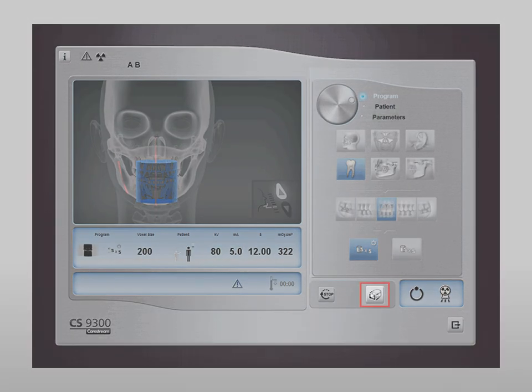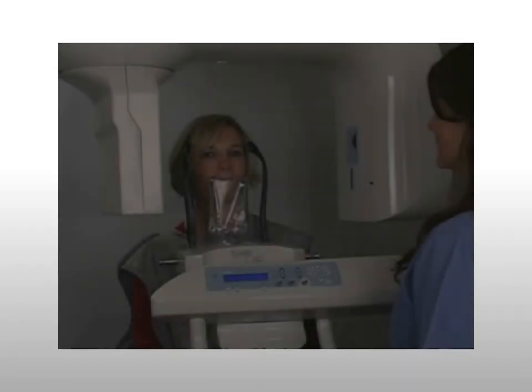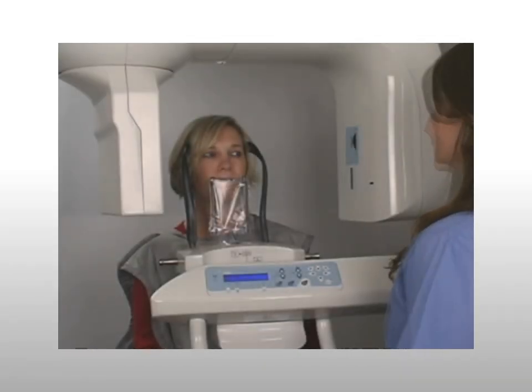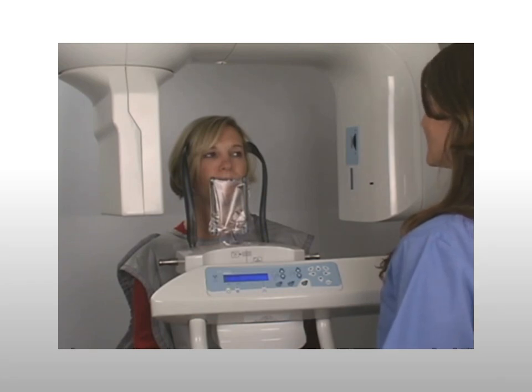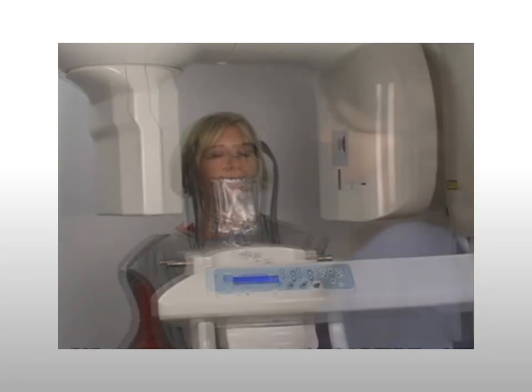If required, click the pre-shoot button to check that the patient is properly positioned in the scout image. Instruct the patient to close on the bite block, breathe through the nose, and remain still. Exit the room and acquire the image.